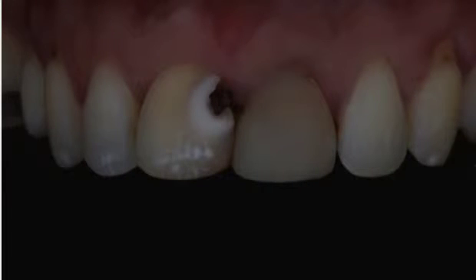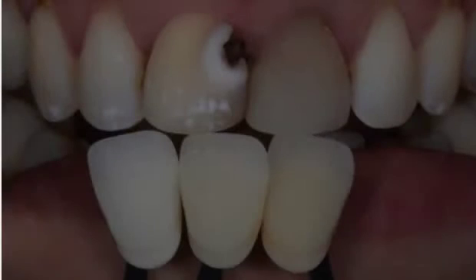This is the image with a polarized filter to be able to give color information to my dental technician, because this case will be managed in an indirect restorative way. We are going to create metal-free ceramic restorations.